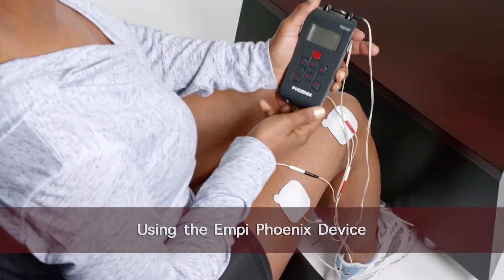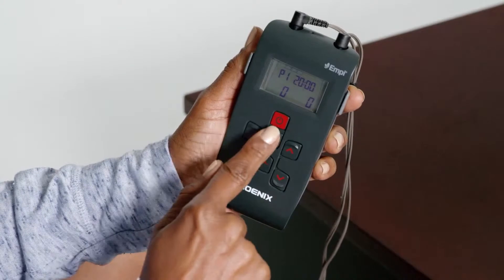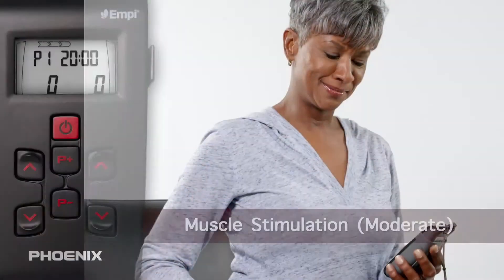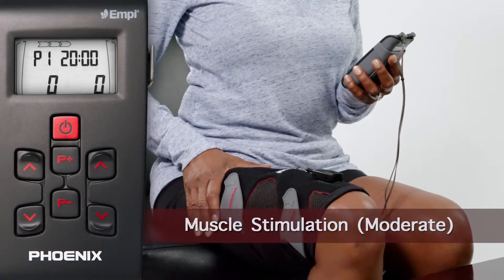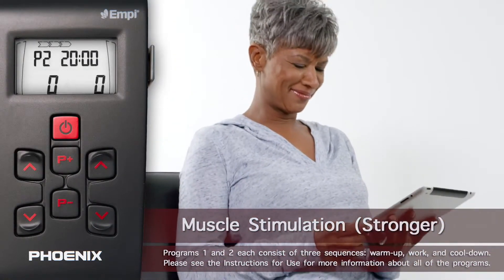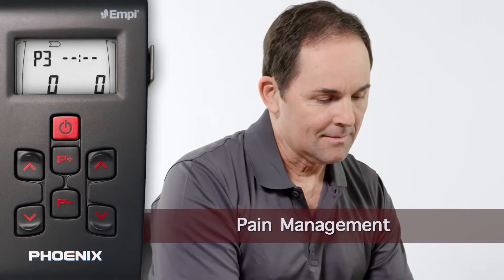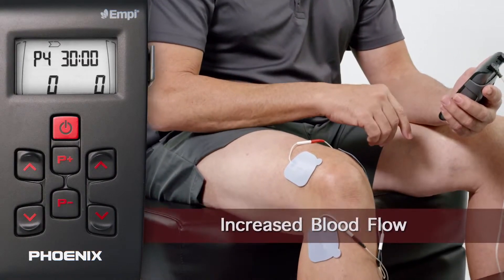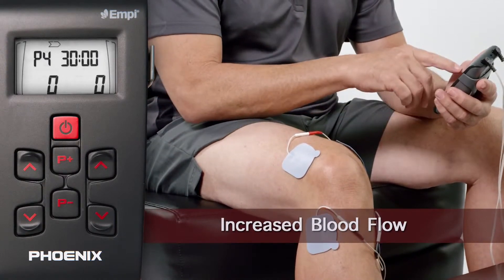Once the device is connected, turn it on by pressing the power button in the upper middle of the device. There are four programs on the Empi Phoenix device. Navigate the device to the program prescribed to you by your healthcare provider. Program 1, or P1, is a neuromuscular electrical stimulation program designed to generate a stronger muscle contraction. Program 3, or P3, is a transcutaneous electrical stimulation program intended to help manage localized pain. Program 4, or P4, is a pulsed direct current program designed to help increase local blood circulation.